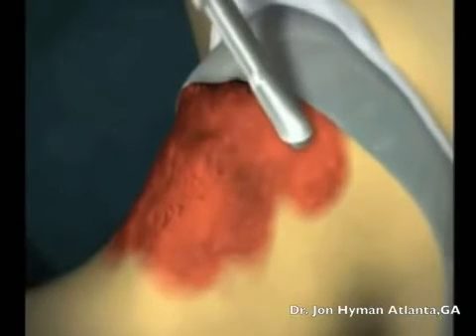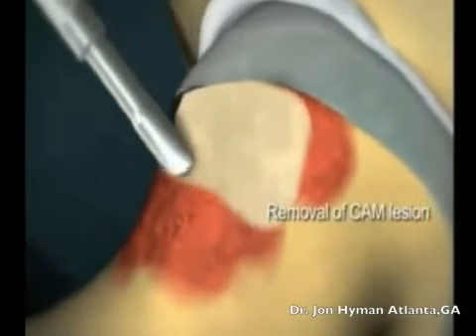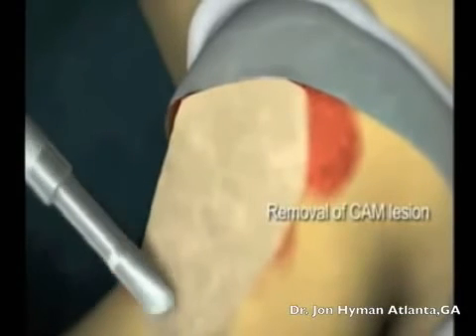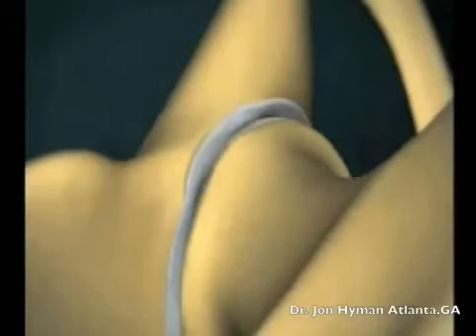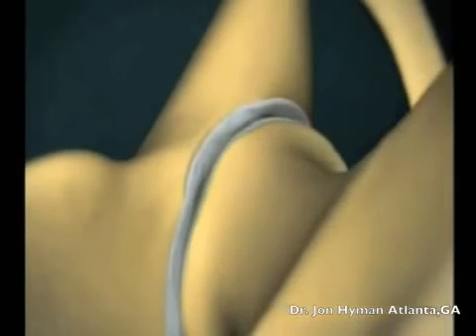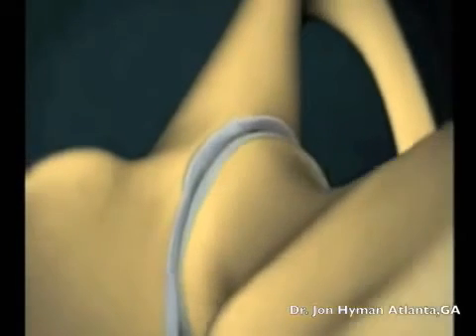The cam lesion is removed from the femur. This is done to restore the normal sphericity of the femoral head. Fluoroscopic and arthroscopic visualization helps to recreate the normal offset. At the completion of the resection, the hip is moved around to confirm that the impingement lesions have been removed.